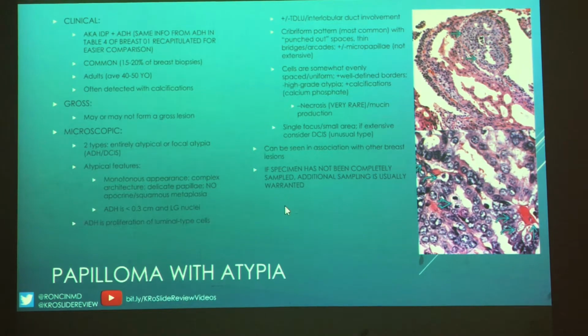These are relatively common, right? We see them all the time, and they tend to be in middle-aged women. You can see cribriform. You can kind of see anything, but we saw a lot of cribriform in our case. And like I said, they're all potatoes. They're not all gourds, and they really like their personal space.